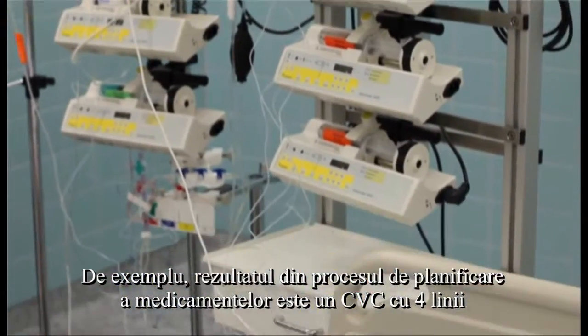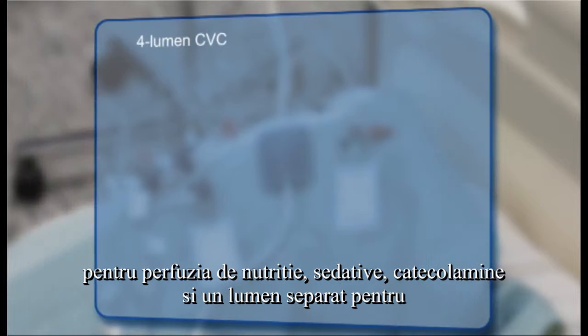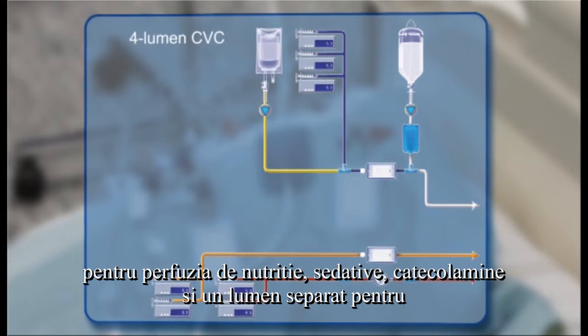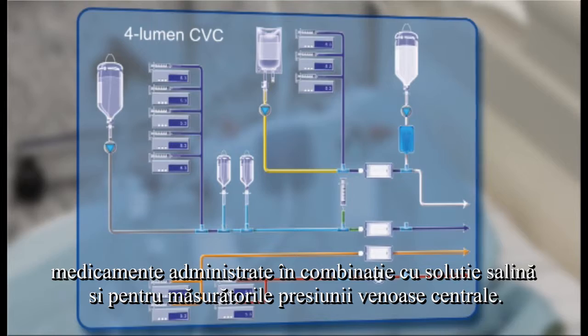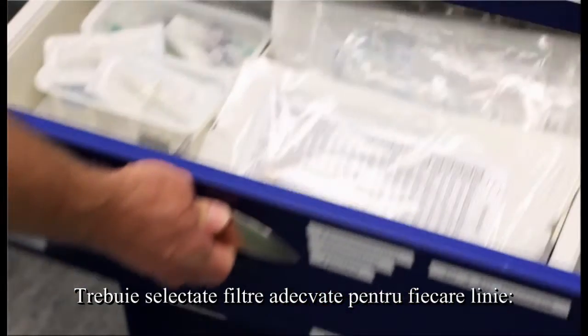For example, the result from the drug planning process is a 4-lumen CVC for the infusion of nutrition, sedatives, catecholamine, and a separate lumen for drugs given in conjunction with saline solution and for central venous pressure measurement. Suitable filters have to be selected for each line.